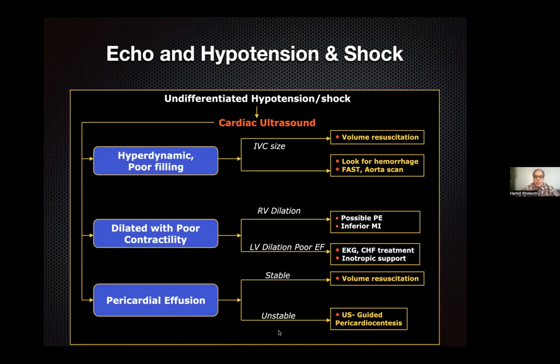And you see the pericardial effusion. What is the most important and first treatment for pericardial effusion and tamponade? Maybe not everybody, but some of you may say pericardiocentesis. That's not necessarily the right answer. The most important one is to increase the intravascular volume and pressure by giving fluid.